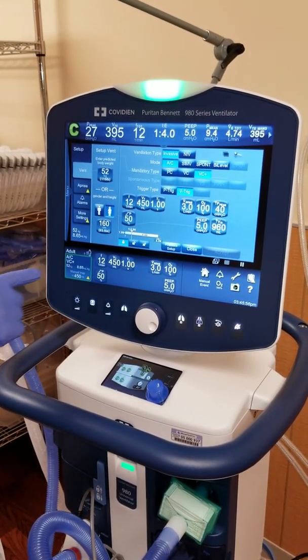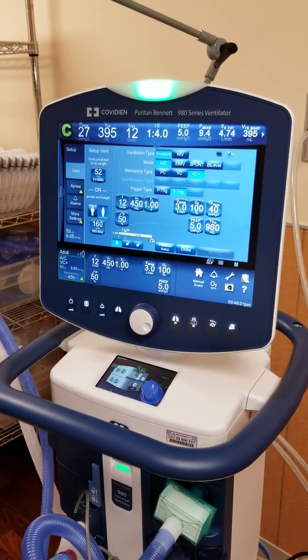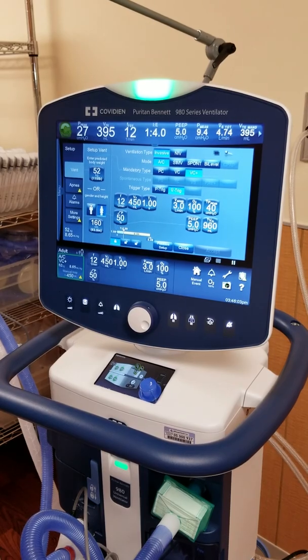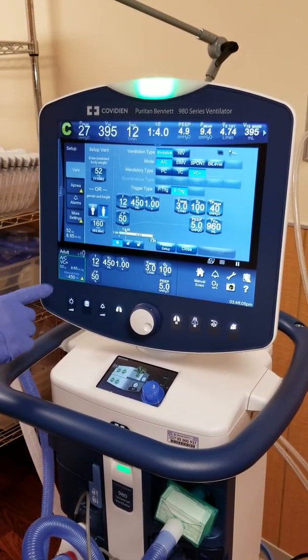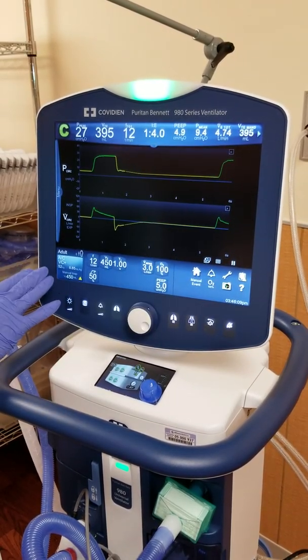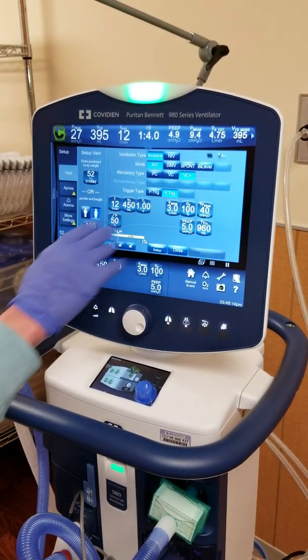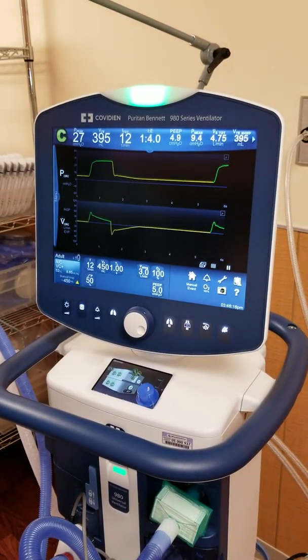You're going to see this VC plus. What this is going to point to is more of a PRVC, a specific type of thing that we will always dial in. So how did I get to it? I just tapped on it. Everything is touchscreen. So you get your modes there. It'll pop up here. You can hit it again and it'll go away.